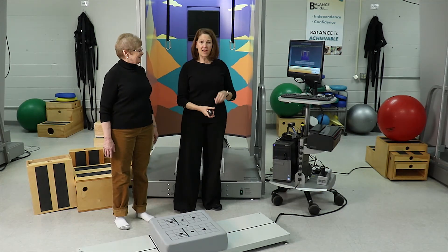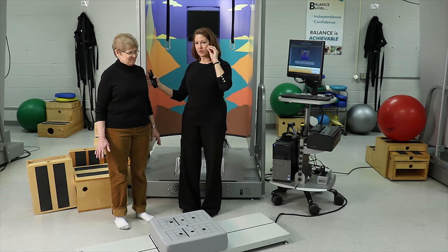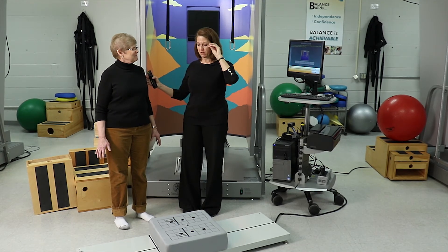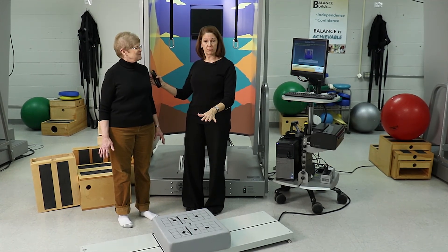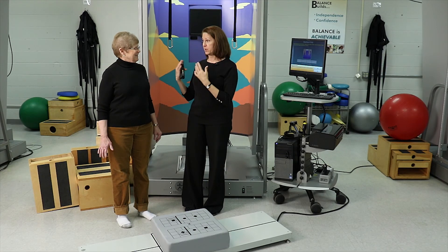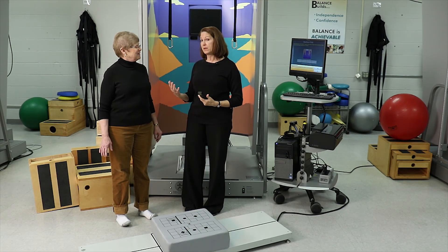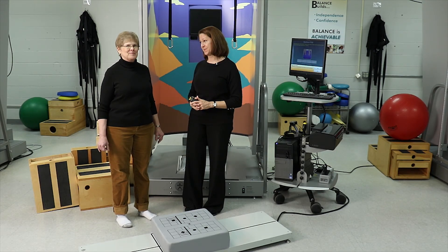In that last condition, when she is standing on the foam with her eyes closed, we eliminate vision and we disadvantage the use of somatosensory information for balance. The only reliable sense she has is her vestibular system. That gives me a good idea that her ability to use vestibular cues for balance is intact.